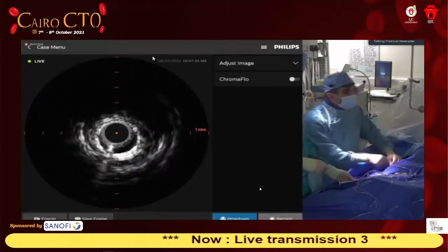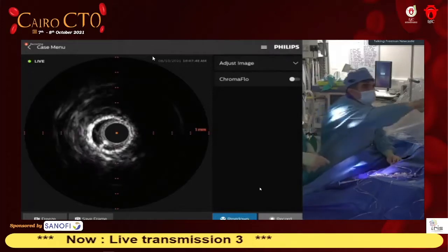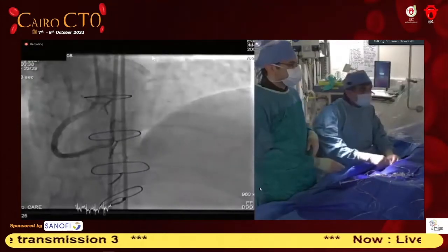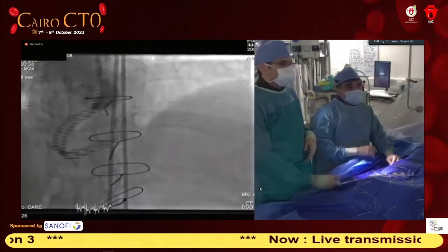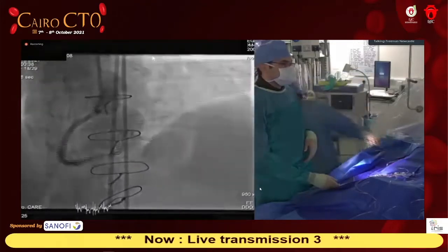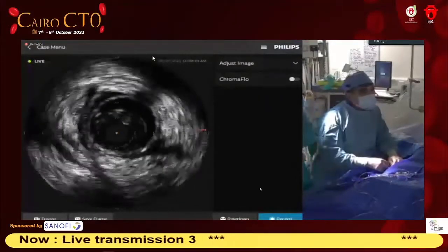David, can you go back one for me, please? So where the competitive flow is coming, it goes horizontal toward about 4 o'clock. My first wire was in the top branch. Now it's gone to the main branch, which we saw in the earlier images. Can you ring down for me, please? Okay, ring down. Okay, good. You can see that even the 4.0 stent still looks a bit small, though it is well deployed, and the cross-sectional area is big enough, but we'll try to get you there. Here we go.